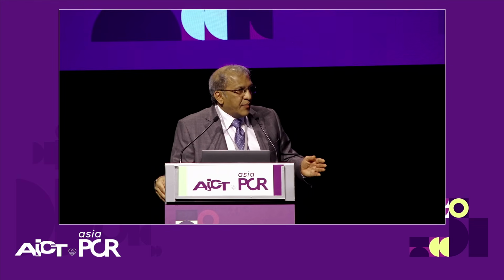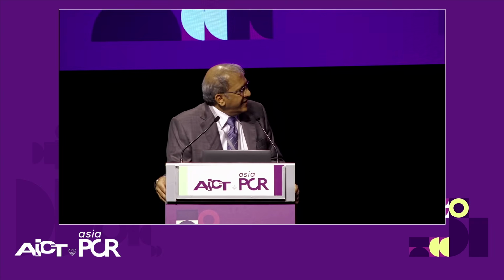Yes. So I have a comment on the preparation bit. I think sizing is the key. If you're going to go up to sustained high-pressure devices like the Wolverine or an OPN balloon, I think the key is to size it appropriately. And if you see eccentric calcification with a normal segment, it's safer to undersize. And I think that's the key. That's the only thing. Thank you very much.